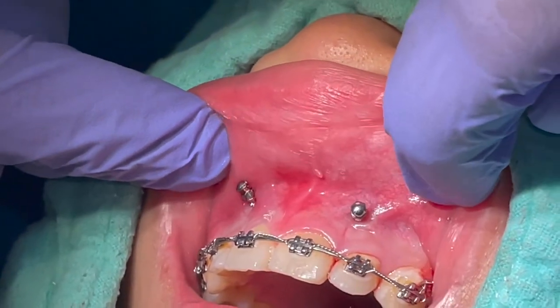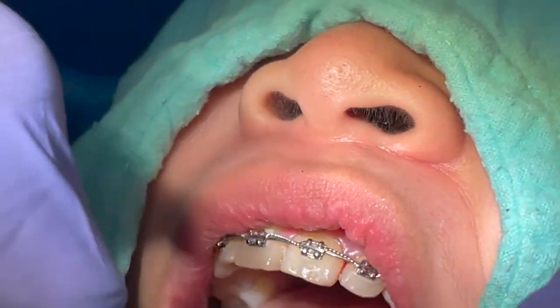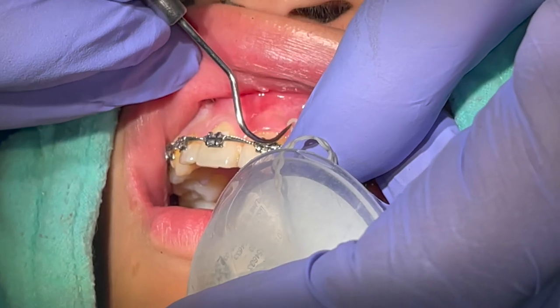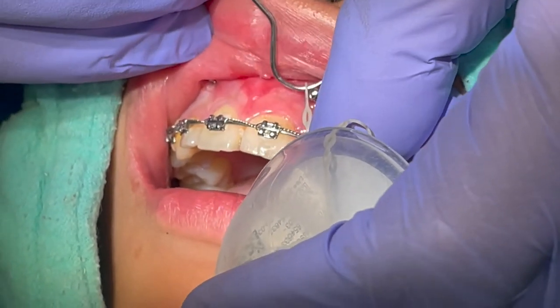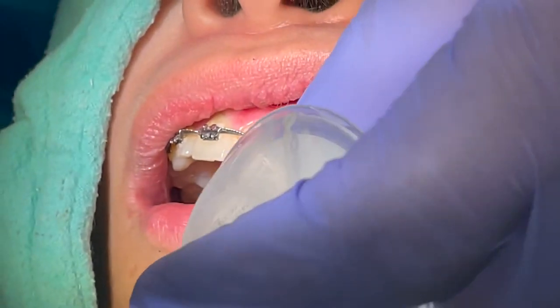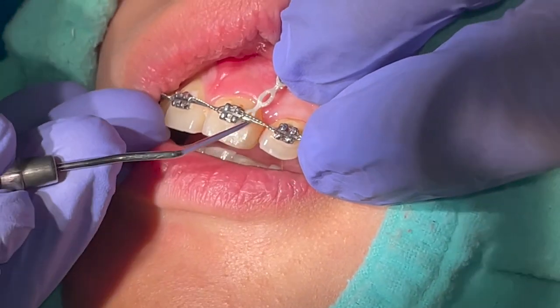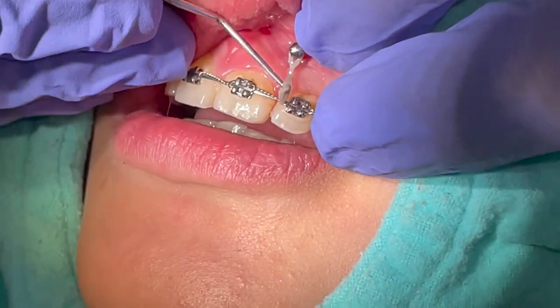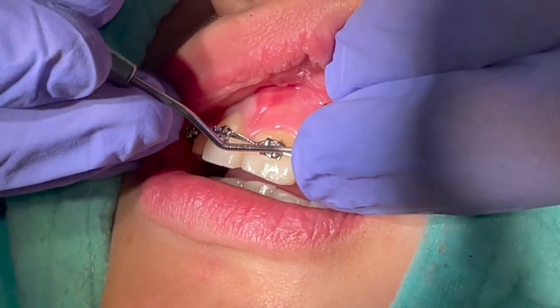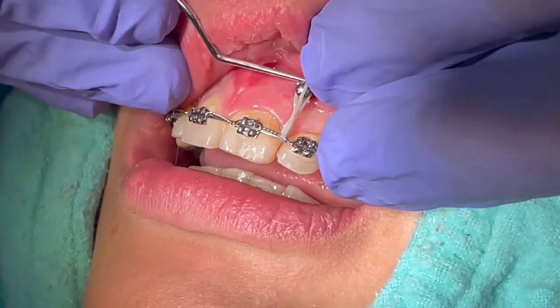An open coil spring or an elastomeric chain can be used to deliver the intrusive force. However, you must keep in mind that the application of the force is labial to the center of rotation. This creates a moment that tips the crowns labially. However, in this case, this was counteracted by a horizontal force coming from an existing infrazygomatic TADs.